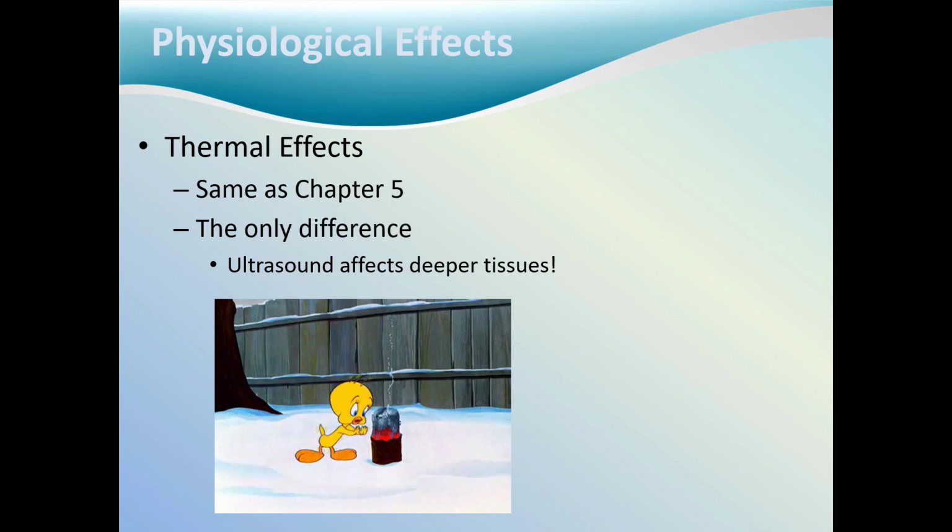The primary purpose of thermal ultrasound is to increase tissue temperature. The clinical effects of thermal ultrasound include, but are not limited to, increased tissue extensibility of the collagen fibers in tendons and joint capsules, reduced viscosity of fluid elements in the tissues, decreased joint stiffness, reduced muscle spasms, diminished pain perception, increased metabolism, and increased blood flow.